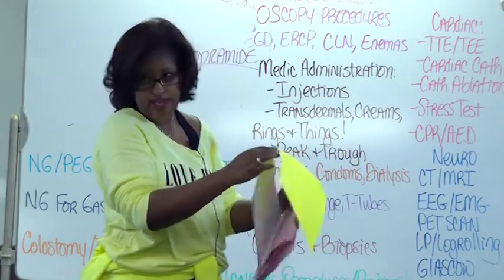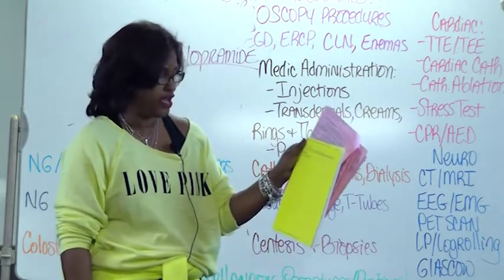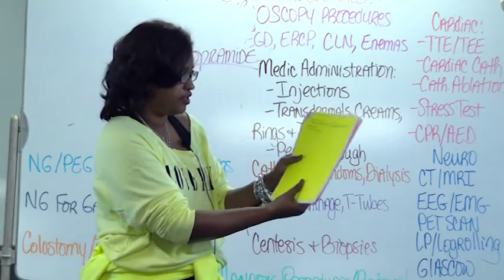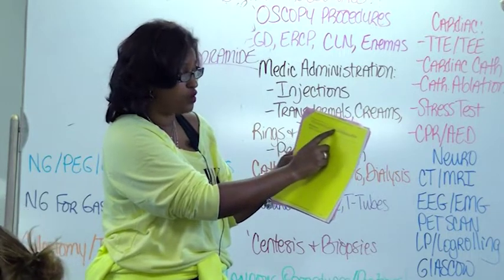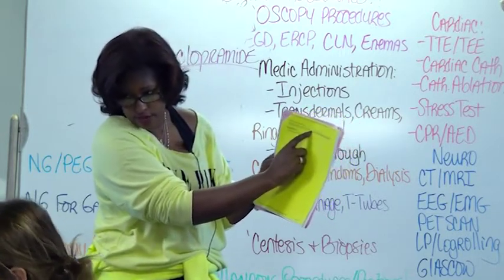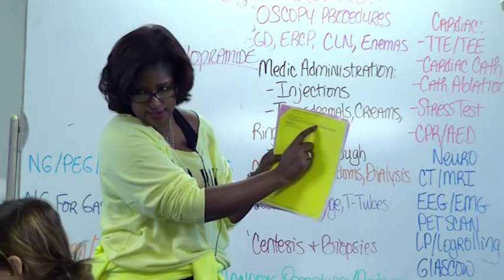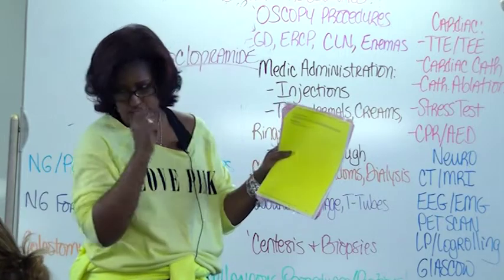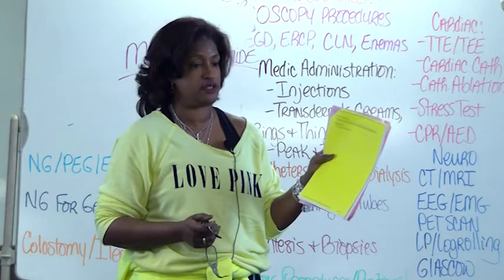After you're all done, and by the way, I don't use 30. Look at the next page. After you're done, if you look at the next page, I don't do 30 cc's of water. Y'all see it? How much do you think I do? Knowing that I'm very neurotic. 60, yep. It ain't but one sentence on that next page. But trust and believe it's an important sentence.